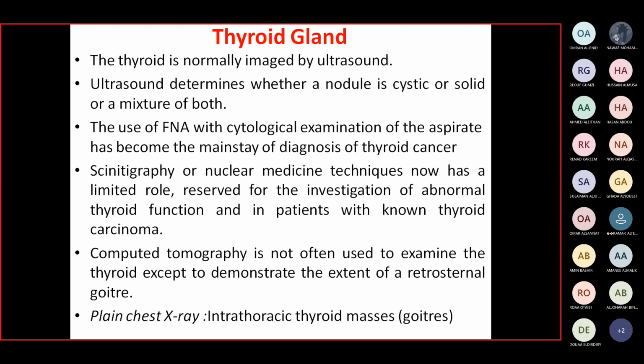Is it cystic or solid? Because this is important in differential diagnosis, to reach the diagnosis. Ultrasound helps us differentiate the nature of this tumor or nodule. Also, ultrasound can be used for guidance of fine needle aspiration for cytology, which now has become the mainstream diagnosis of thyroid cancer.